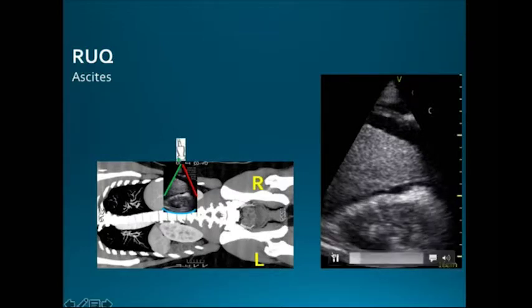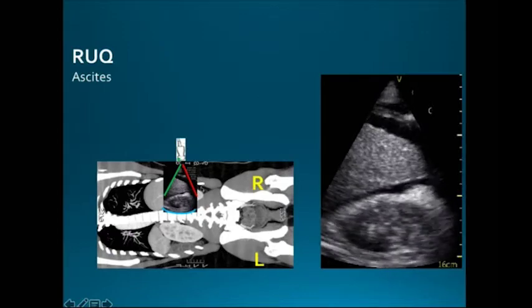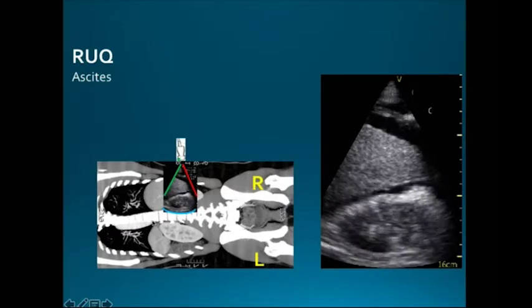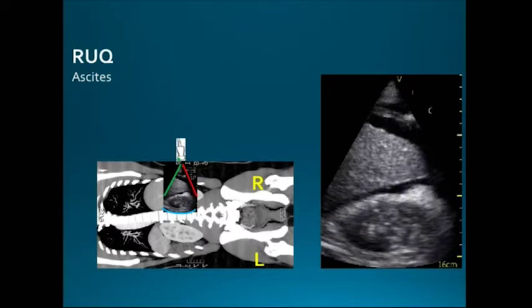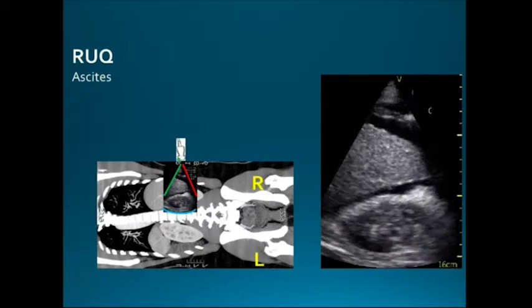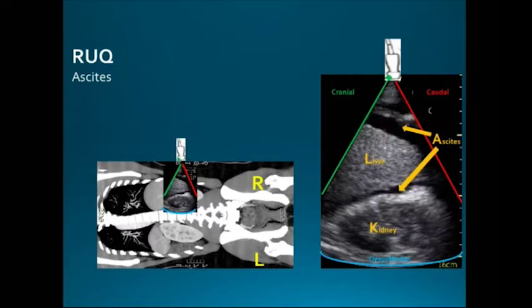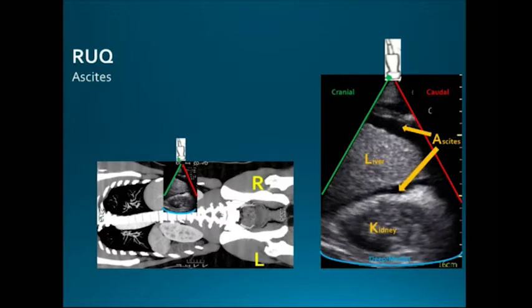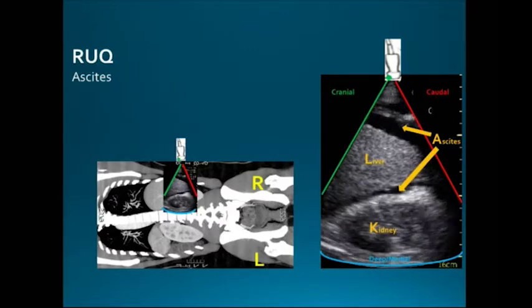Yeah, great, thanks. And can you click on the one superimposed on top of the CT scan? Yeah. So this is the ultrasound image superimposed onto the CT scan to scale to show you the orientation. So this is kidney, this is liver, and the orientation's all the same here. And this is the ascites track in between here and here. And you guys notice there's a little rough texture. So you can actually sometimes see cirrhosis using this technique as well.